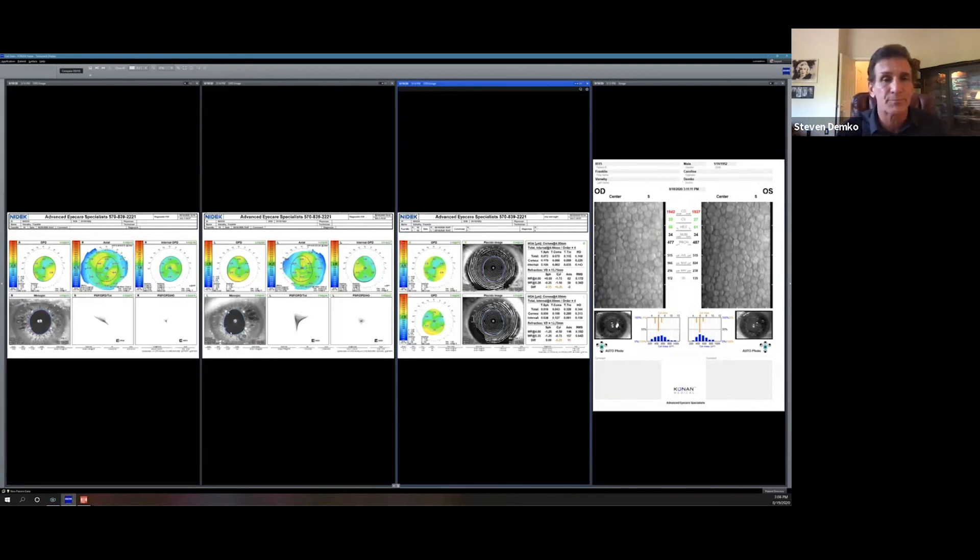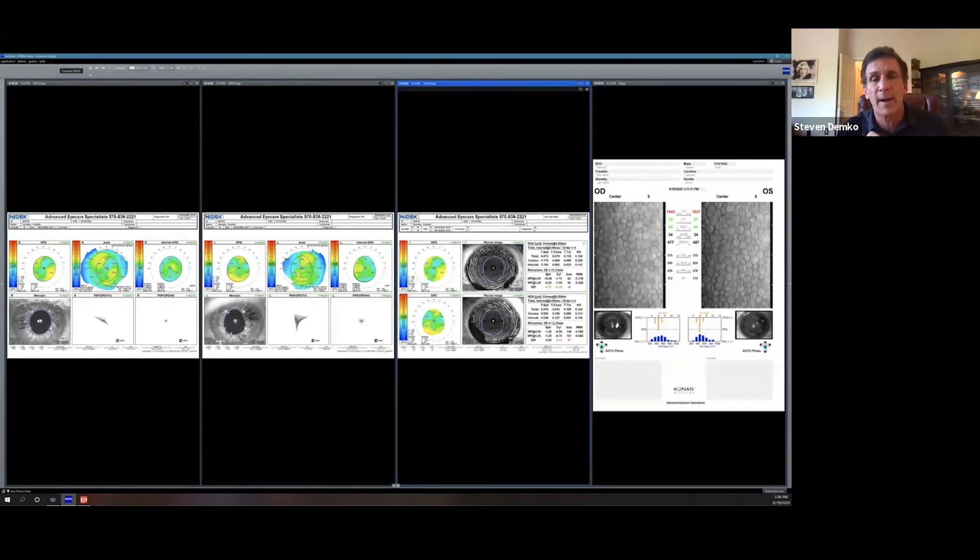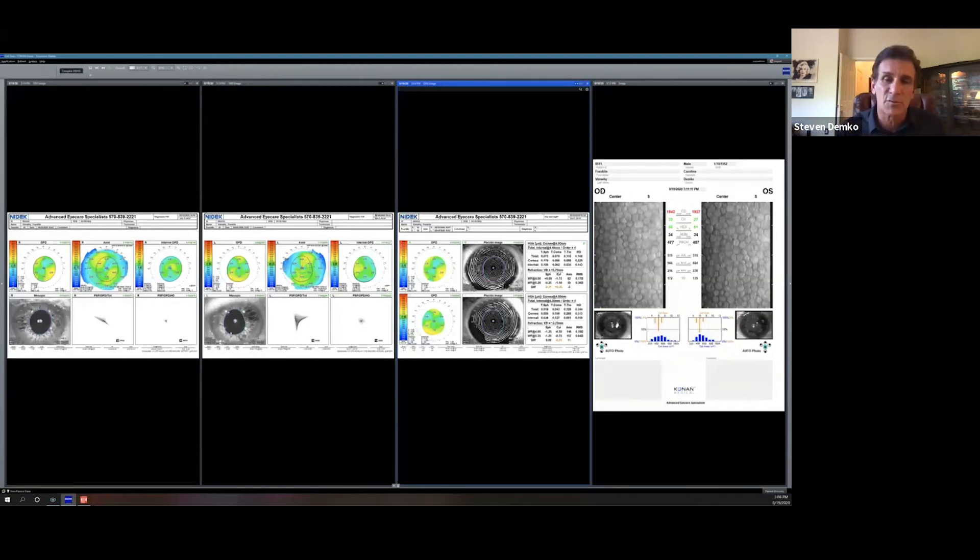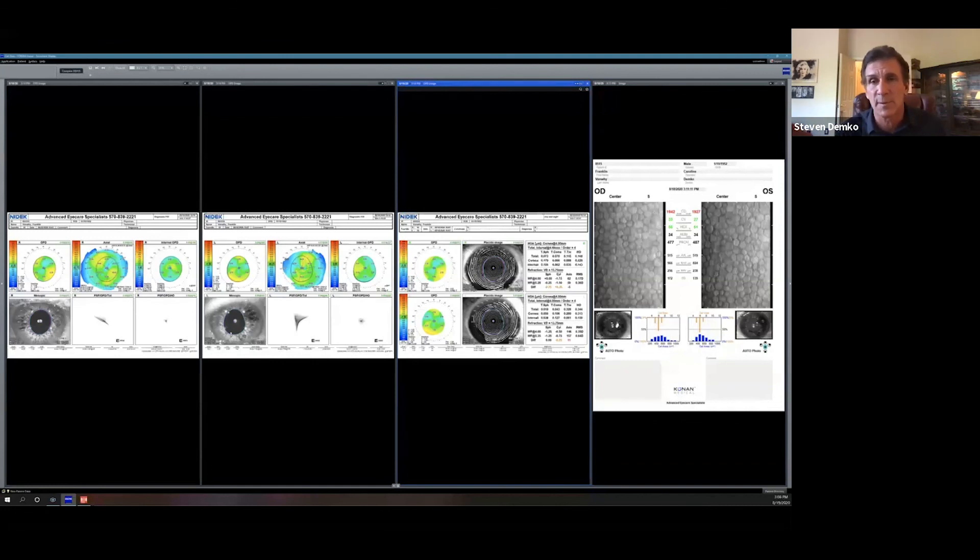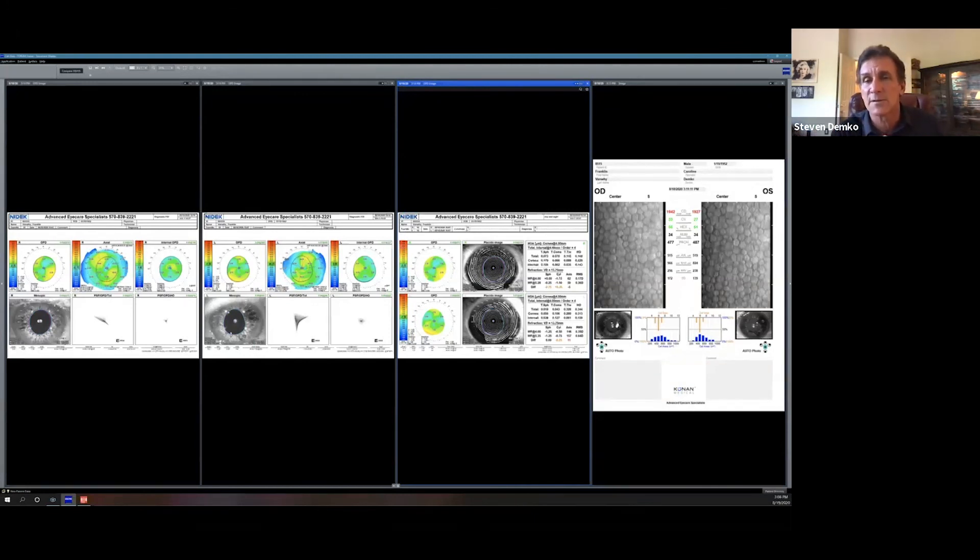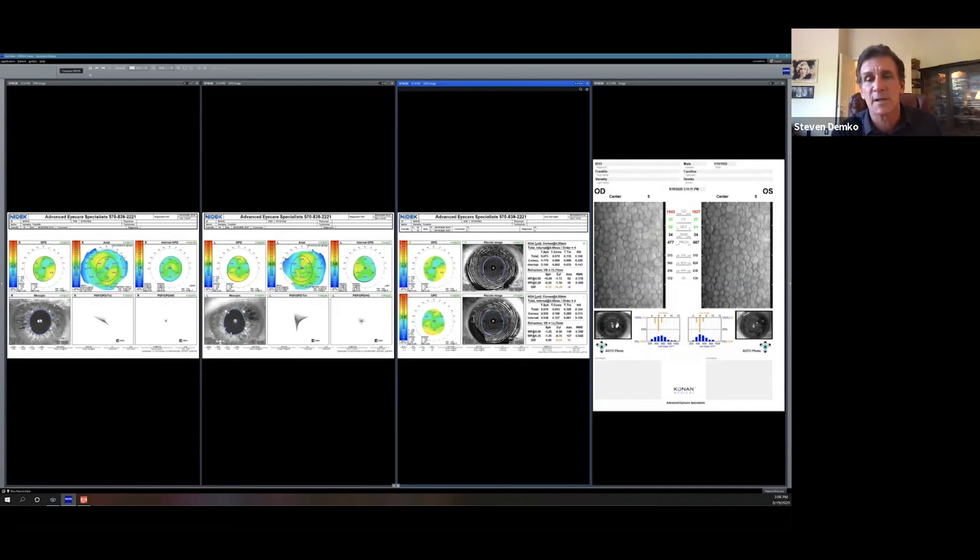So in this particular patient, I saw this. I got back to the notes and I saw real quick, oh, by the way, he has Fuchs dystrophy. So quickly, I just drug down, saw that we had a specular and I pulled the specular up and I looked at the specular. Well, I could see the central aspect of the cornea. There aren't any guttata in the central aspect. They're all peripheral guttata. So that is not going to be an issue for me today on this refraction.